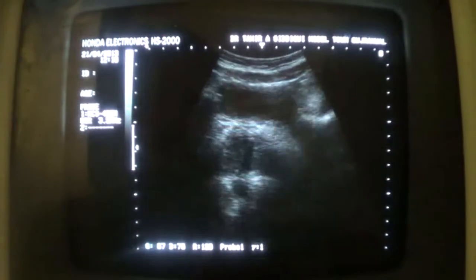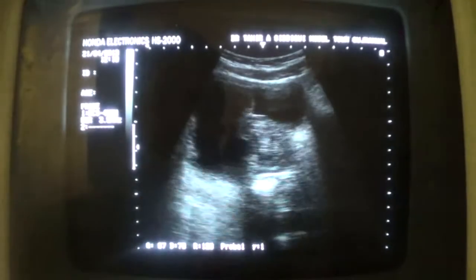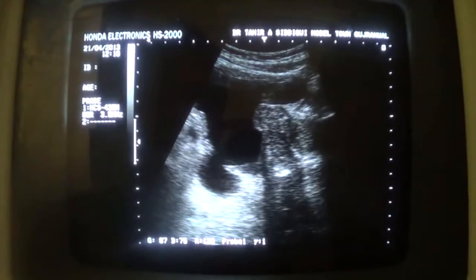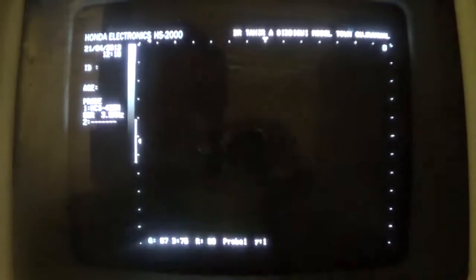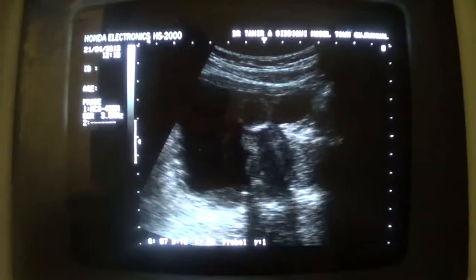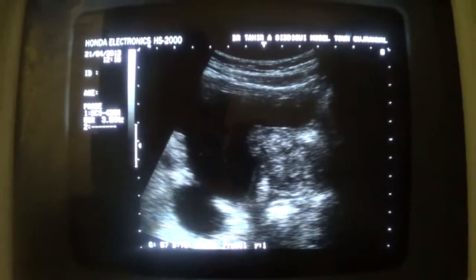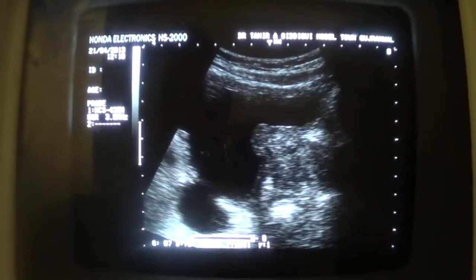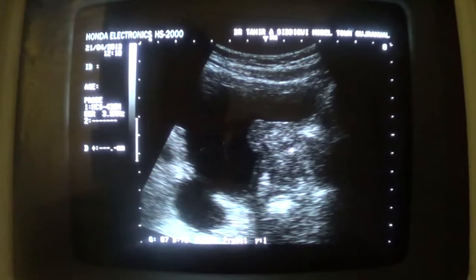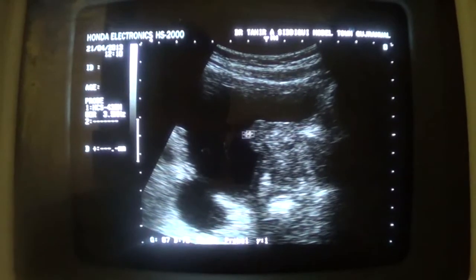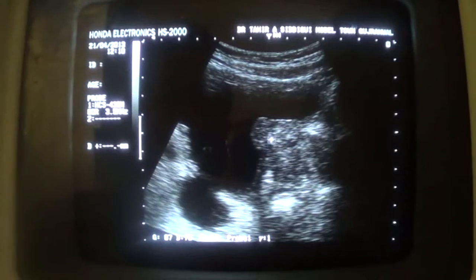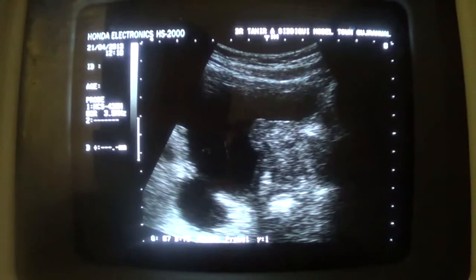Now, let's see the prostate. This is the prostate in the coronal section, in which it gives a homogeneous appearance. This is the large median lobe of the prostate.